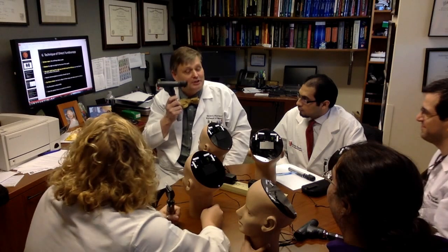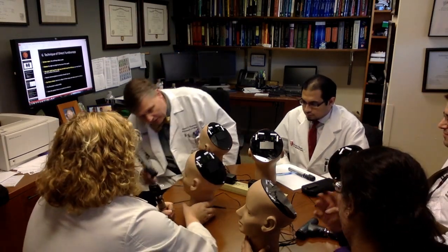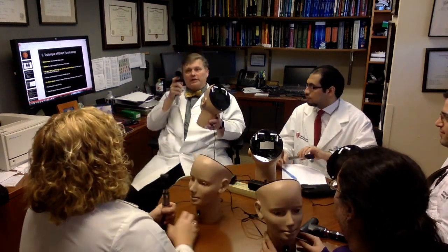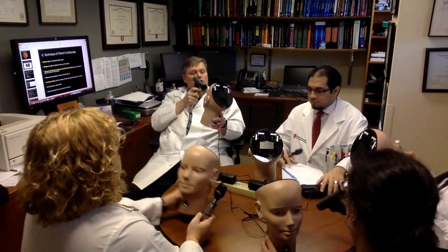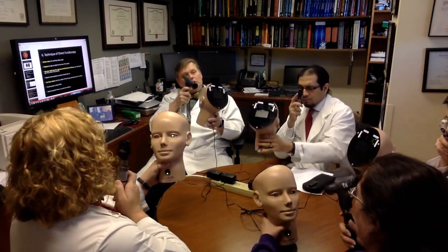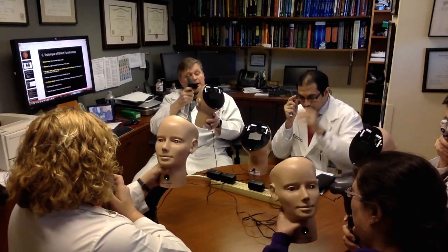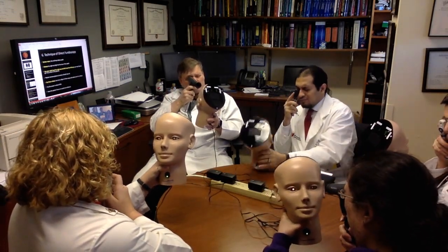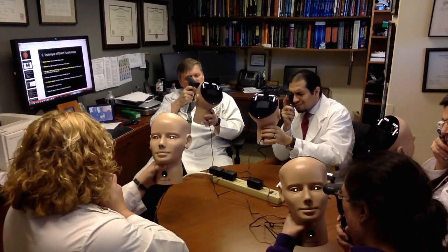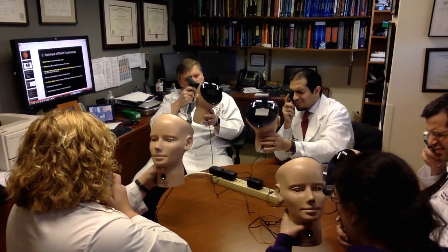Now, you get to turn your ophthalmoscope off because there's actually a light in this thing. Okay? So now what you're going to do is take the head. Again, you focused in about 10 feet away. You're going to come in at approximately 15 degrees off the midline. You don't come straight in because, remember, the optic disc is off towards the nasal side. So you're straight in with the patient. You're about 15 degrees off, and you look at the eyeball, and hopefully you should see a red reflex. It's not really red. It might be orange, red, pink.